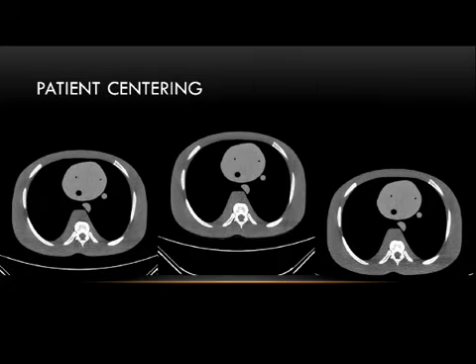But so here's a little example. I took this chest phantom, Chester as we call him, and placed him. This is located at isocenter in this position, raised 4 centimeters here and lowered 4 centimeters here. All right, and had the exact same tube current modulation settings for these scans after doing each one of these localizer radiographs.